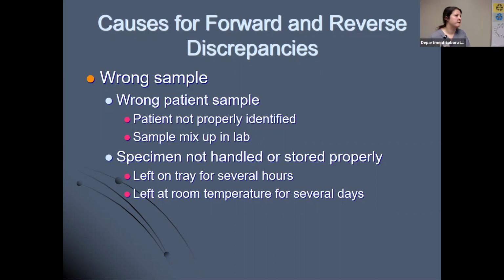If you accept samples from, let's say, a hospital that has many satellite clinics, especially in blood bank, if you have any OB clinics where moms are being drawn at about 16 weeks, mom will have her blood drawn to determine her ABO RH. If she is RH negative, she will get RhoGAM. And then if there's any delay in that testing, maybe they forget to send it for 2 or 3 days, that could alter our testing as well, because we just don't want it sitting out at room temperature. When we receive the sample, we do our testing and then we put it in the refrigerator. Okay.